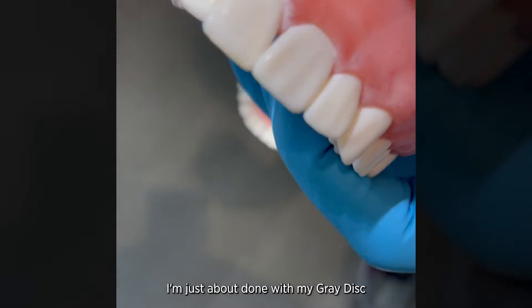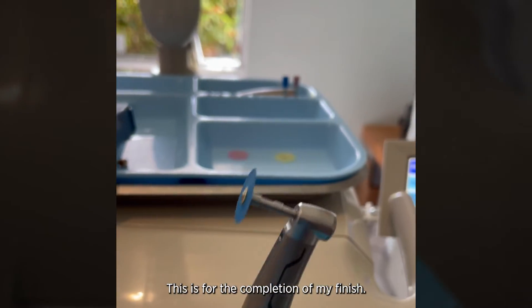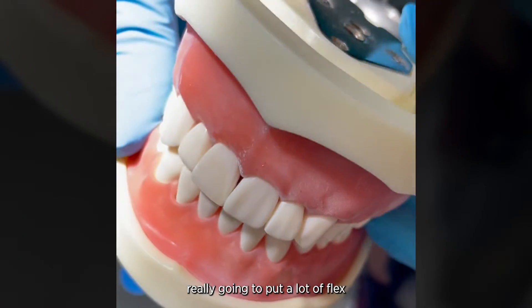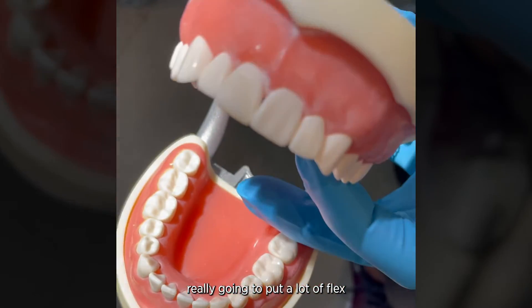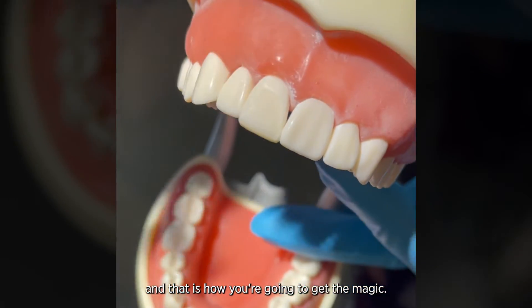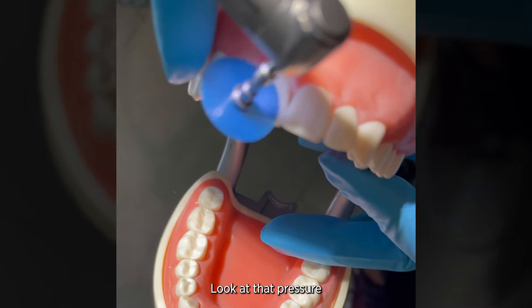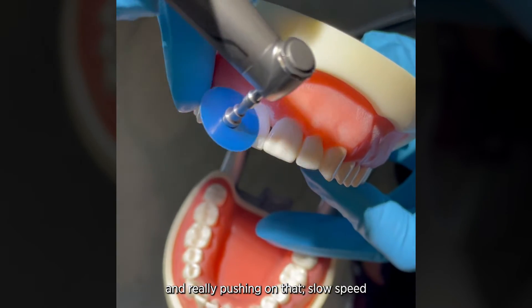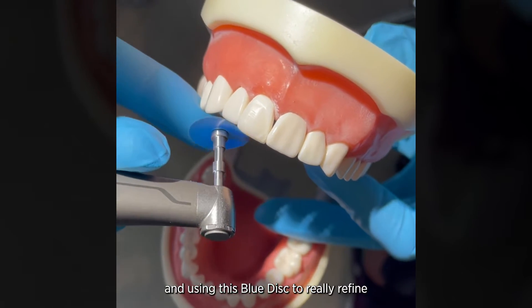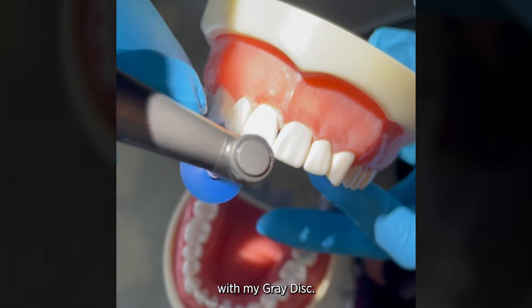Now I'm just about done with my gray disc and I'm going to move to my medium flexi disc. This is for the completion of my finish — it really helps remove scratches and I'm using it at 10,000 RPMs. You're really going to put a lot of flex and pressure on this disc and that is how you're going to get the magic. I'm using this to really refine and contour everything I just created with my gray disc.